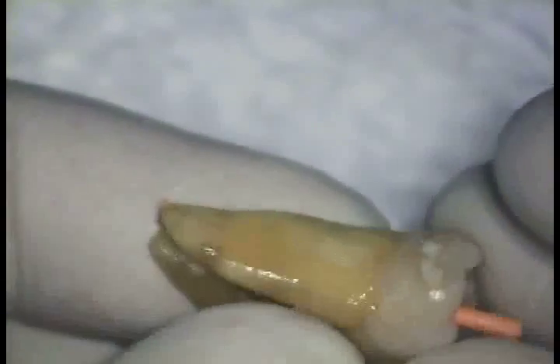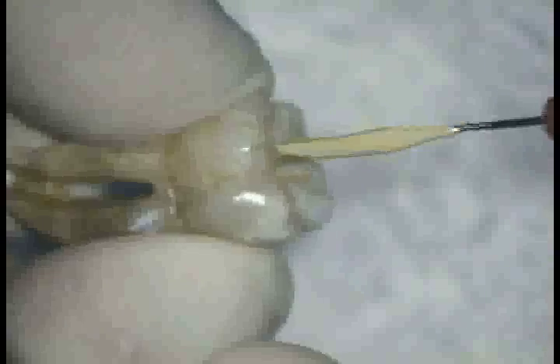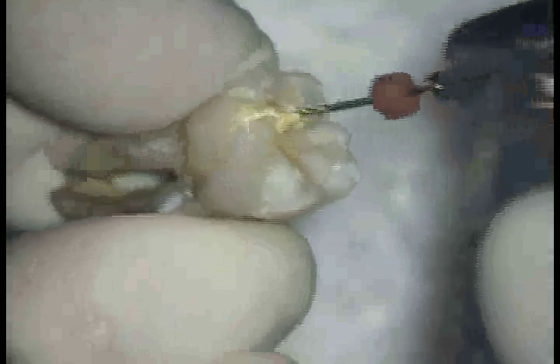All that the 2506 imparts is a greater taper in the middle and apical thirds of the canal. The canal is dried. The medium gutta-percha point is adjusted for a tight apical fit with tugback. The cement is now applied using the bi-directional spiral, 3 mm short of the apex, loaded like a corn dog and applied with 6 to 7 strokes.